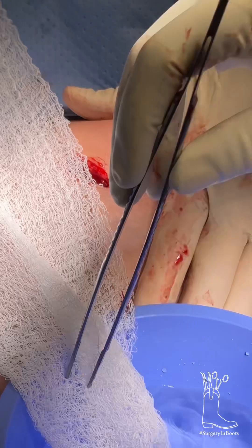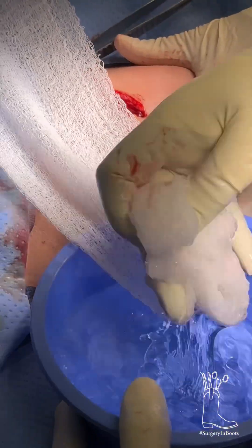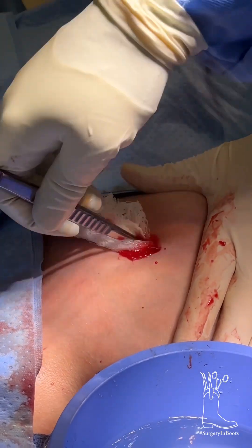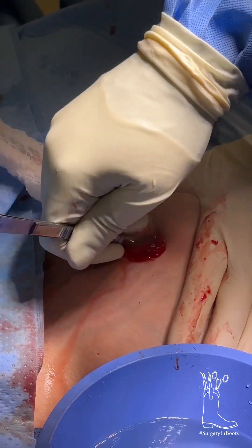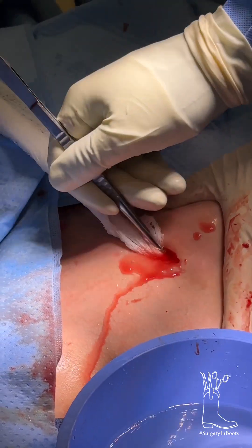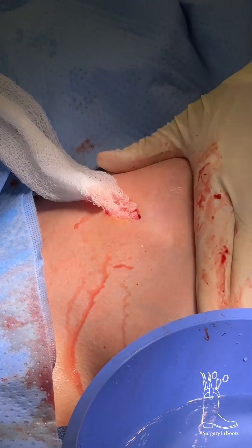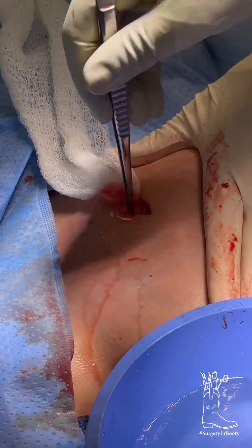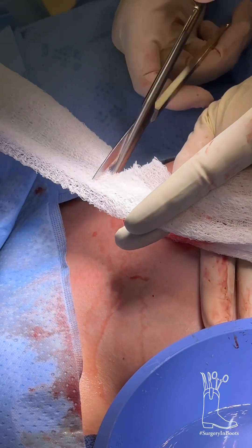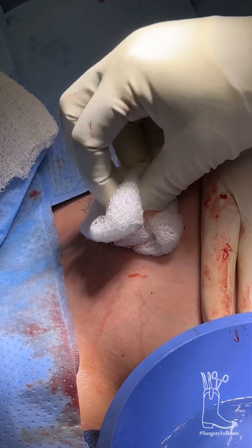A true wet-to-dry is when you take the gauze — the amount you think you're going to put in the wound — and keep it wet. It doesn't have to be sloppy wet; bring it out so it's just moist. Then you take this and put it in the wound, as much as you can. It goes this way and a little bit this way. After a while you get to a point where you have the dry part — all of the wet is in the wound and all the dry is out. Cut it and ball it up so that the wet is on the incision and the dry is on the skin.